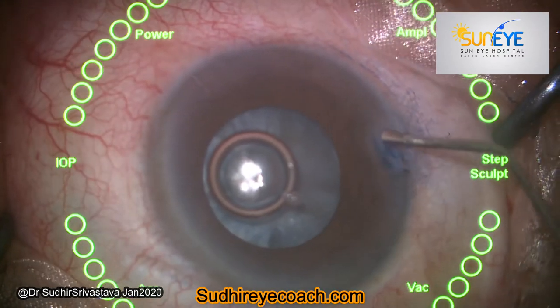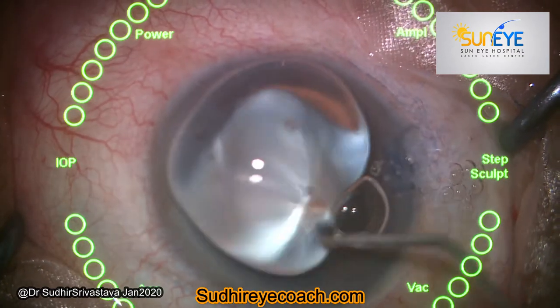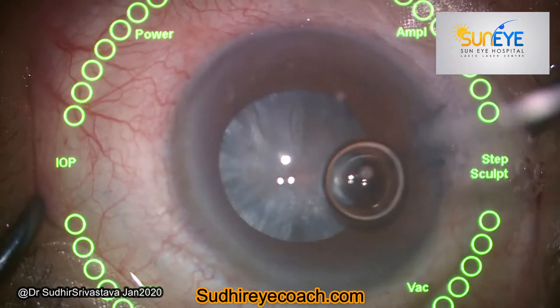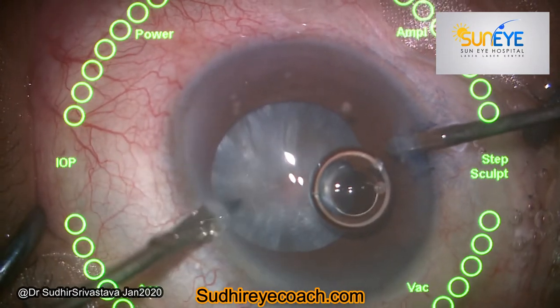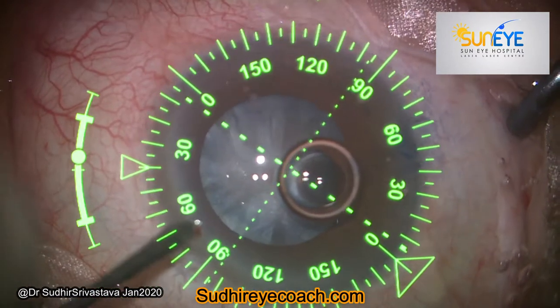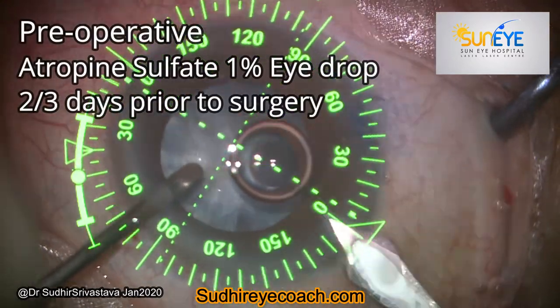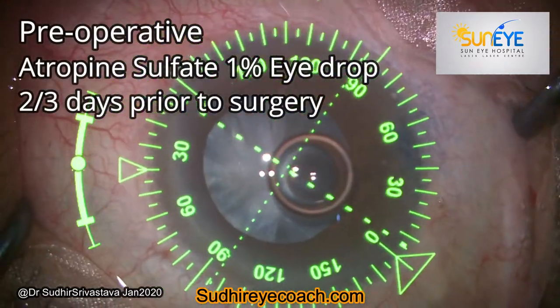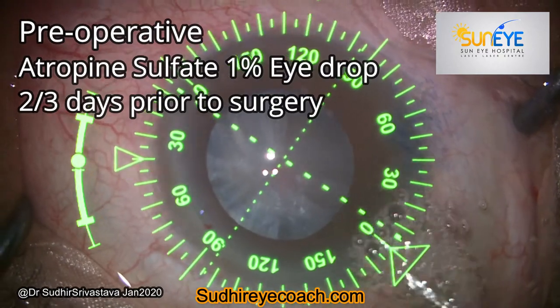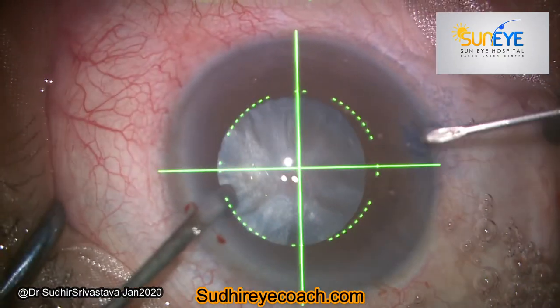Preoperatively, always assess the patient first — do a meticulous examination, check the dilation, and always take a proper history, especially for an old male patient. If the pupil is non-dilating, you can start atropine or 1% eye drops 2-3 days prior to surgery to achieve better pupillary dilation.